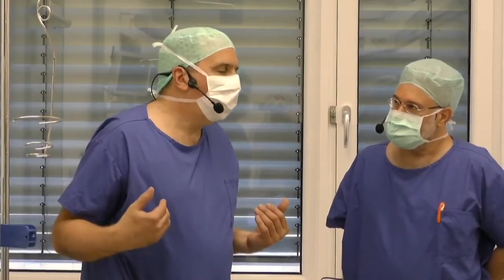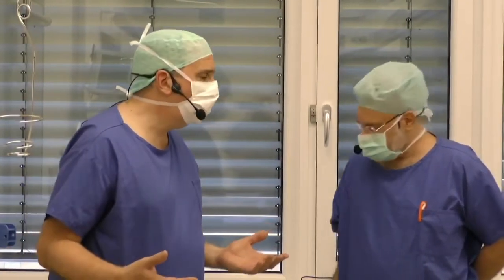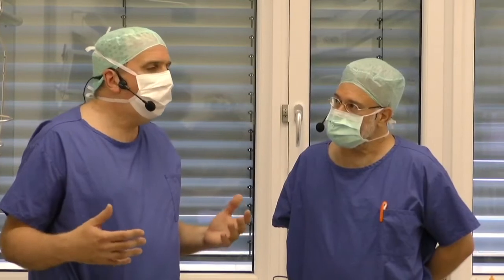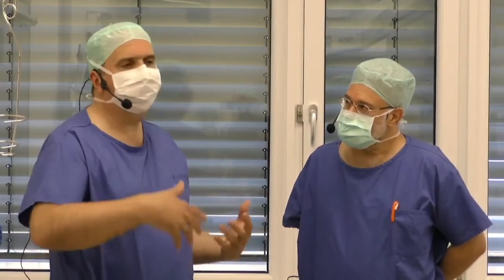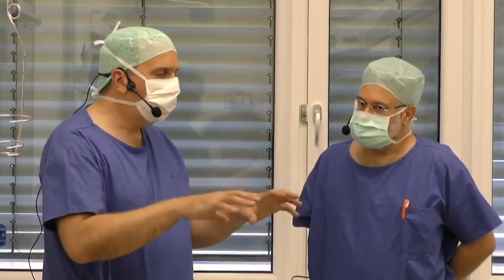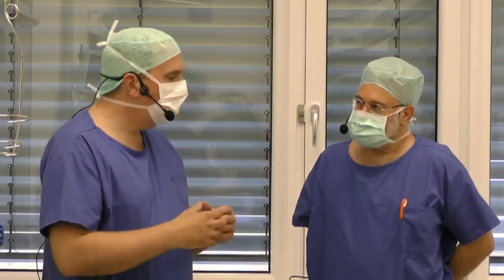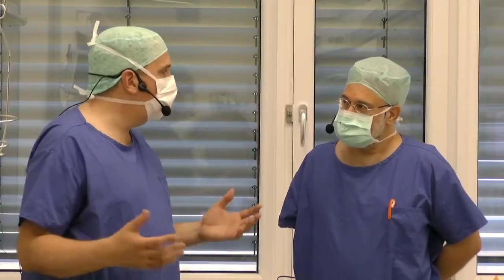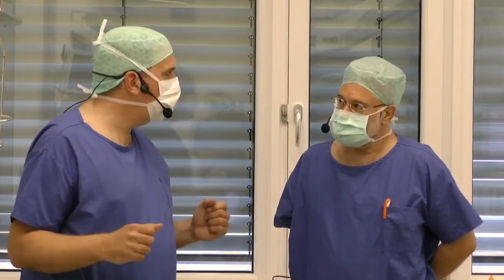It's very easy to explant this lens. We don't want to explant the lens, but it's very easy to do so. We all know it's much more difficult to explant an endocapsular implanted lens after, let's say, half a year or so. The other thing is, if there's any need to adapt this lens, let's say for an astigmatic change or whatever, it's much easier to adapt the lens to the new situation in this kind of lens system, whereas in all other cases, after several months or years, you cannot change anything.